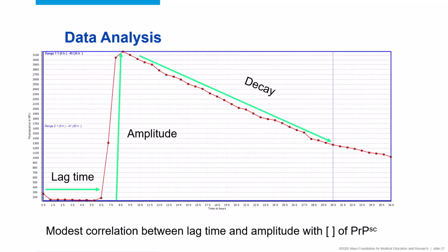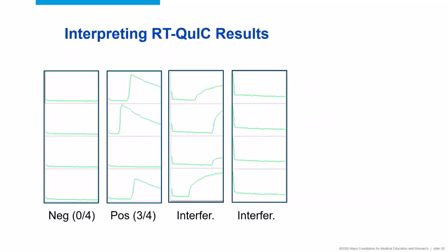Do we see amplification, yes or no? We test each patient in 4 wells. So then the question is, in those 4 wells, how many of those wells reacted? The reactions are generally binomial by nature. So imagine you're sampling out of your CSF sample, you're putting 20 microliters of CSF into each well, and you're basically saying, if I have a lot of seeds in my sample, there's a certain probability that I'm going to get a reaction in any given well. And if you actually dilute out the seeds, it closely follows binomial distributions.